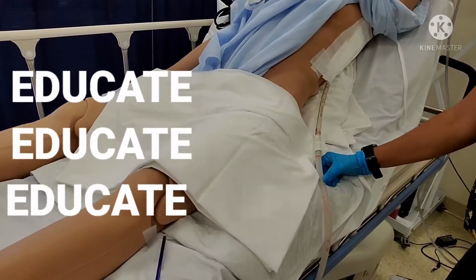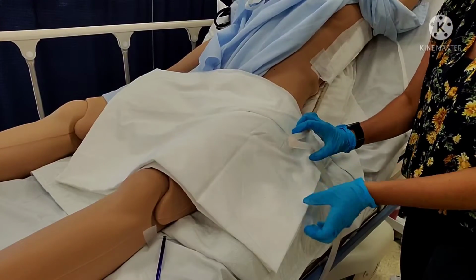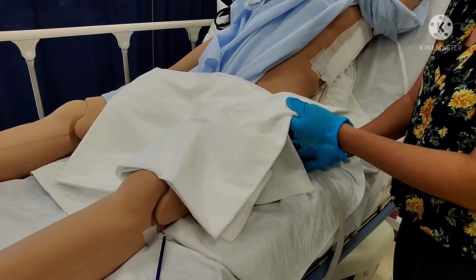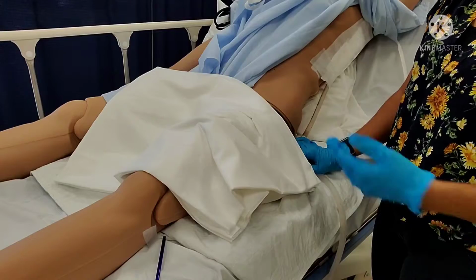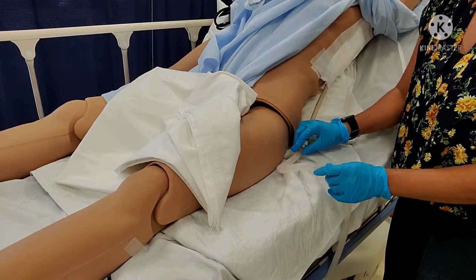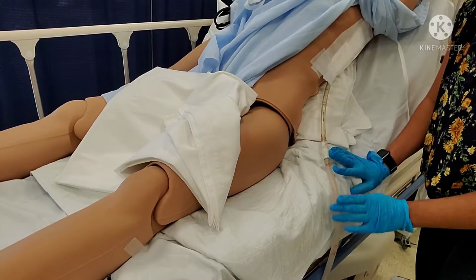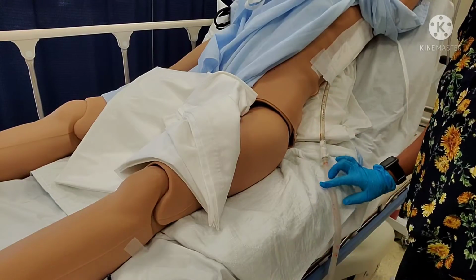So you want to make sure, when you're educating your patient, that the tube should not be under your patient's leg. It's often found under your patient's leg when they come back from the bathroom, or they were sitting in a chair and now they're in the bed. So whenever you're transferring your patient, you want to make sure that the tubing is not getting kinked, that it's not under them, that the tubing is secure. And that's often a question on the NCLEX, okay? We're always going to secure our tubing.